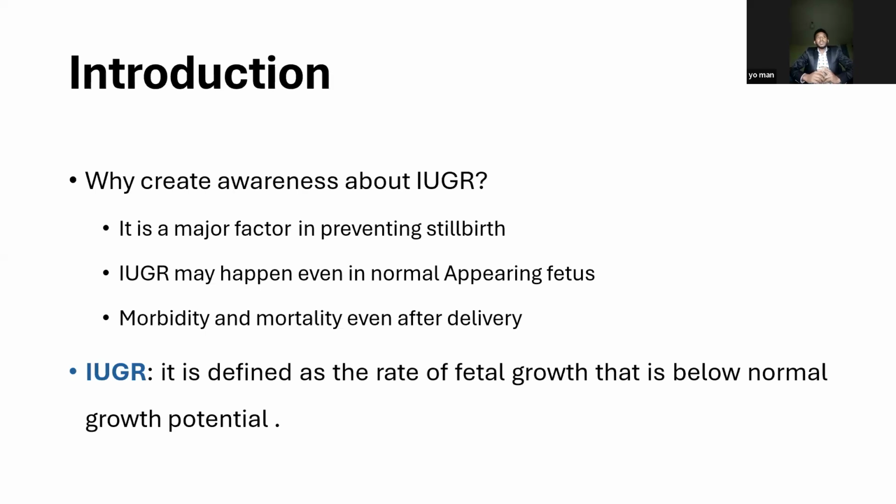Because it's a major factor in preventing stillbirth, and it's the norm in our setting to see a fetus which looks normal, but that normal fetus may appear FGR at the end of the day. So we may fail to diagnose those FGR patients who may look normal.